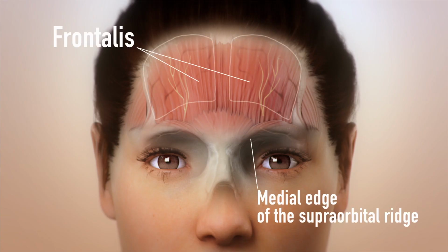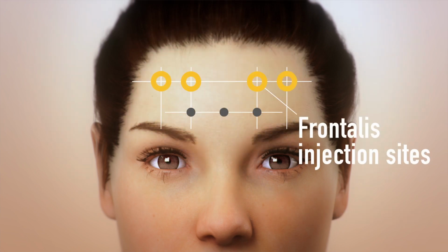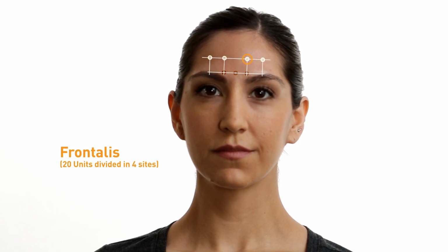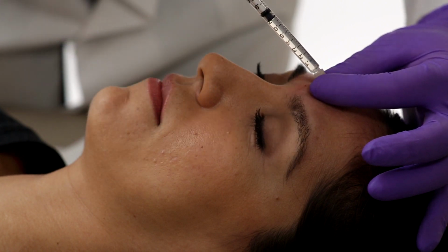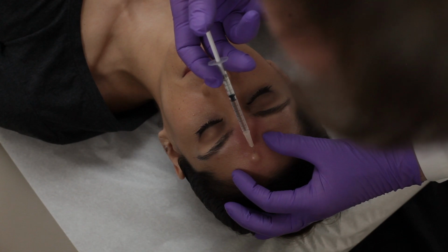The frontalis, a thin, broad muscle, will receive 2 injections on the right and left sides, for a total of 4 injections. Begin by visualizing a line up from the medial aspect of the supraorbital ridge. The medial injection site should be at least 1.5 centimeters or at least 1 finger's breadth above the corrugator injection site in the same vertical line. Ensure that the bevel of the needle is pointed up and that the needle is oriented upward toward the forehead. Make sure the needle stays superficial to avoid the periosteum.